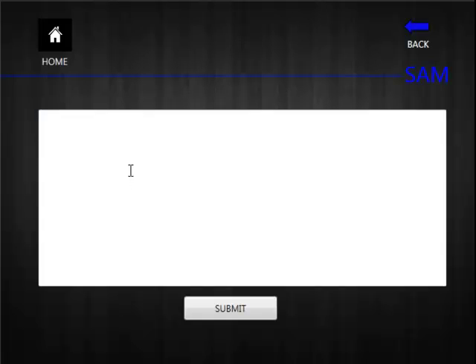And this is the patient's feedback, a similar feature to the doctor's summary, where the patient can give just any feedback, any discomfort they are feeling, or anything of that sort. And this will be submitted to the doctor's login, and they can view it there.